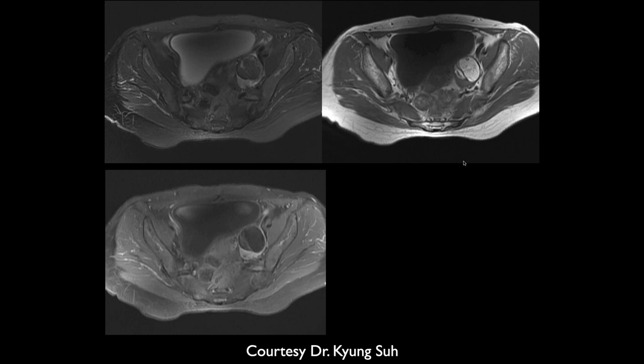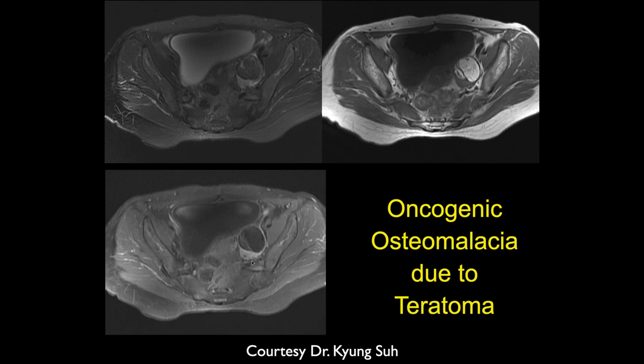We're looking at the psoas muscle on the left side. Is there hemorrhage or is this an abscess? This is a T1. This is a PD fat set. I guess there's definitely fluid along the posterior. Bilateral incomplete fractures.